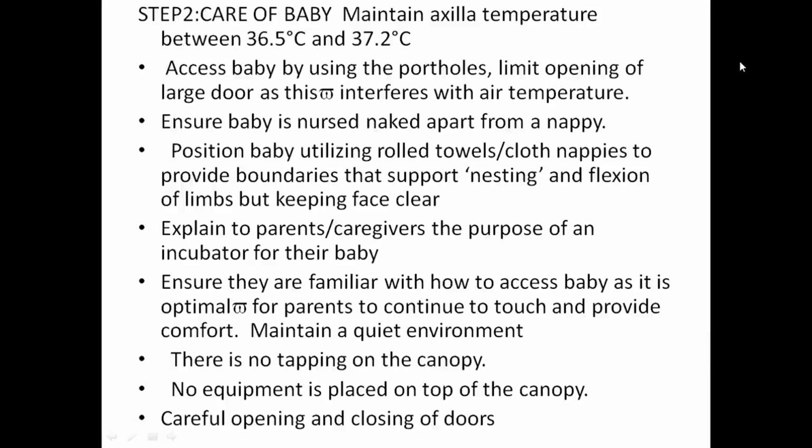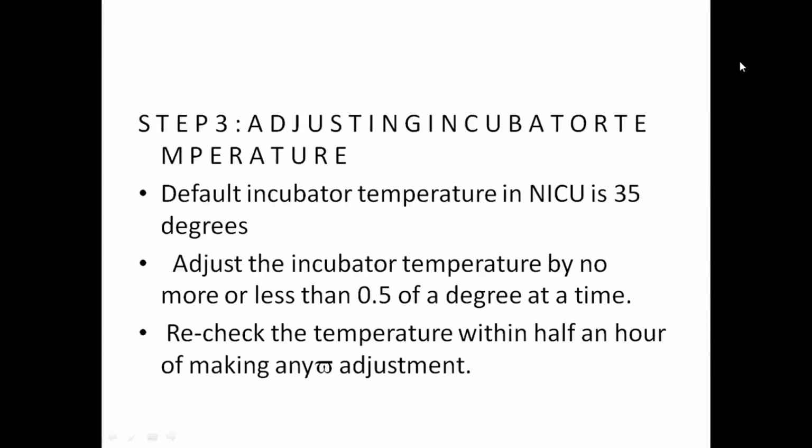Maintain a quiet environment. There is no tapping on the canopy. Nothing is to be placed on top of the canopy. Careful opening and closing of the door. Step 3. Adjusting incubator temperature. Default incubator temperature in NICU is 35 degrees. Adjust the incubator temperature by not more than 0.5 degree at a time. Recheck temperature within half an hour of making any adjustment.